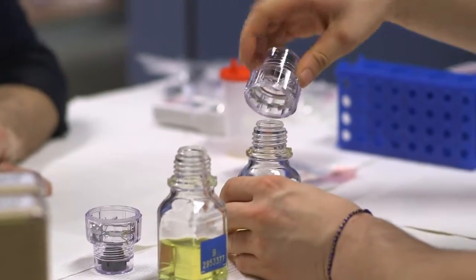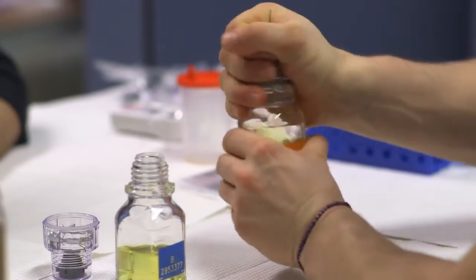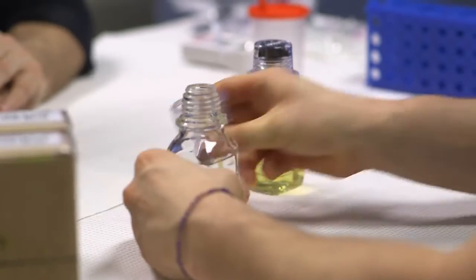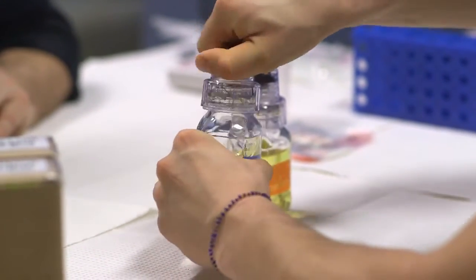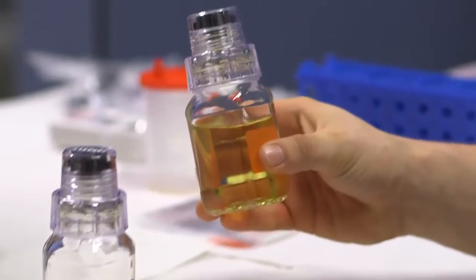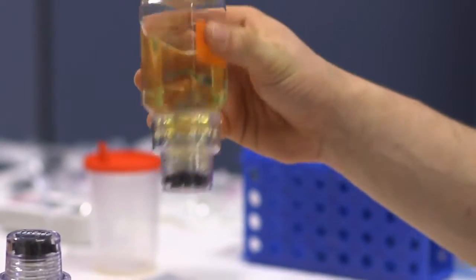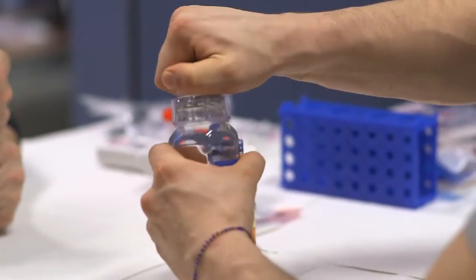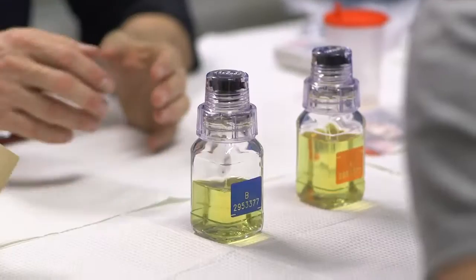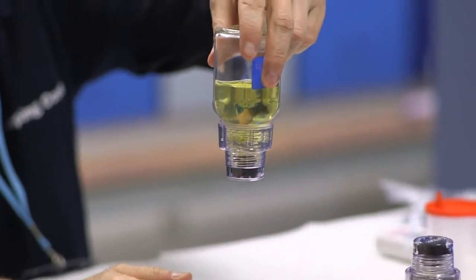The DCO will ask you to place the caps on the bottles and turn them clockwise until they are tight and the clicking noise stops. Ensure the bottles are properly sealed. The DCO will repeat these same steps and then the A and B bottles will be placed into the plastic transport bags.